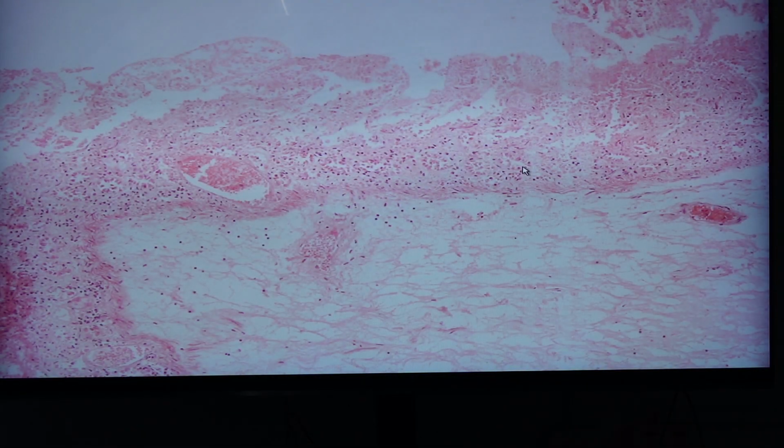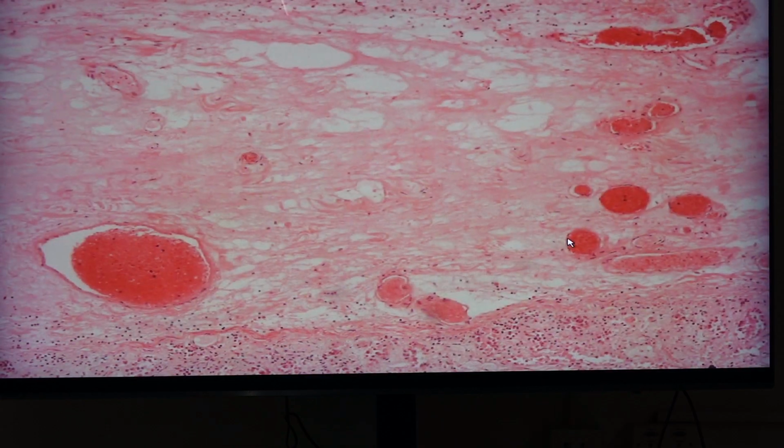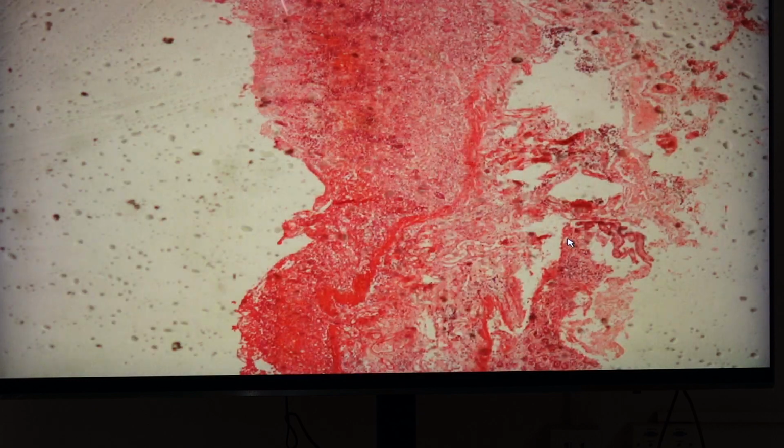The necrosis would extend not only from the mucosa, it goes also to the submucosa, and let's try to find out if there are areas of, I think this one. Okay. You can see some areas that would include already the muscularis. This one. This would include the muscularis portion.